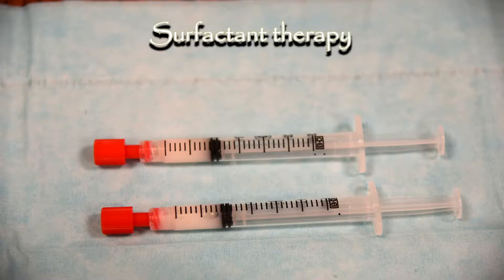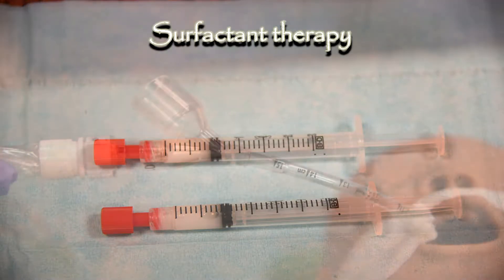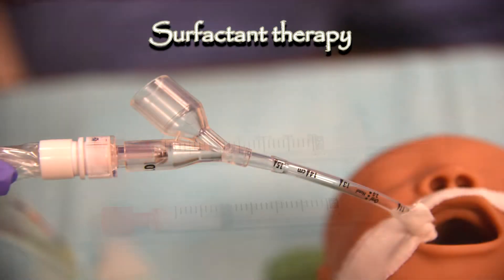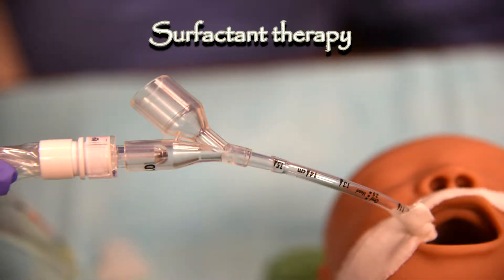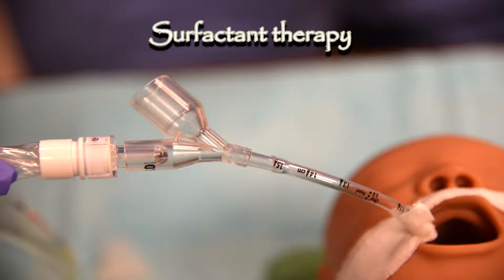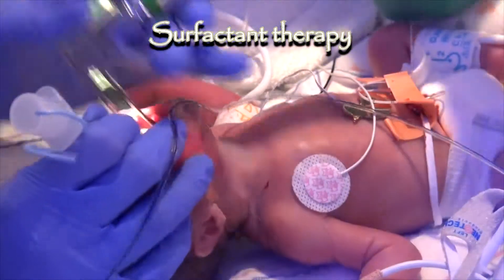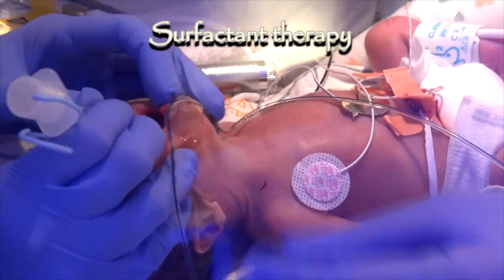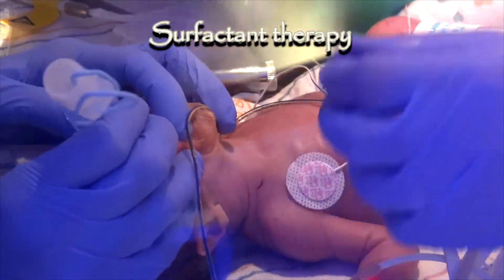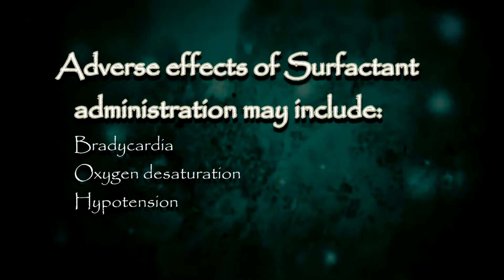Surfactant may be given as either prophylactic or rescue treatment and is delivered via the intratracheal route. Prior to administration, it is important to ensure proper placement and patency of the intratracheal tube.